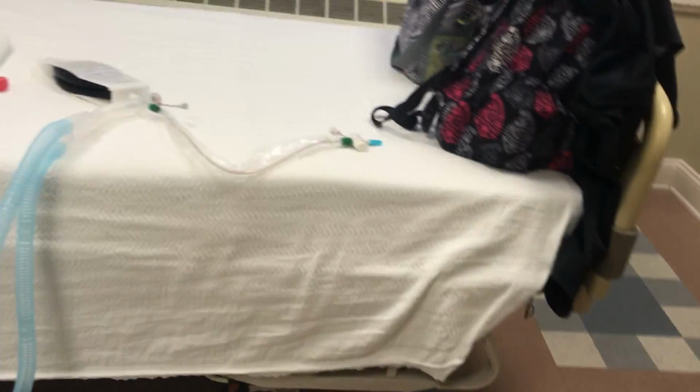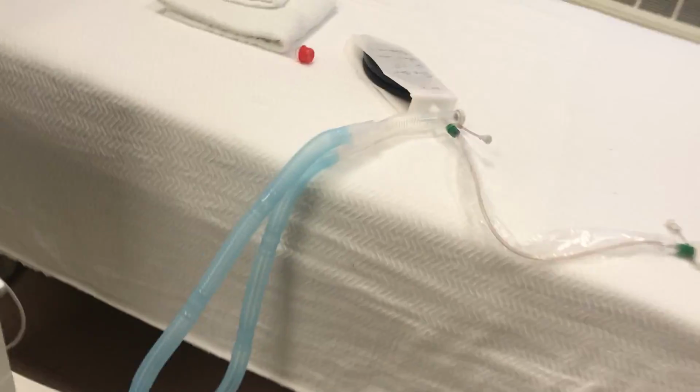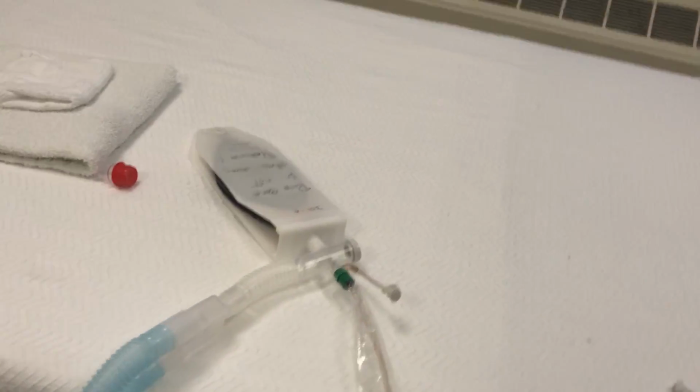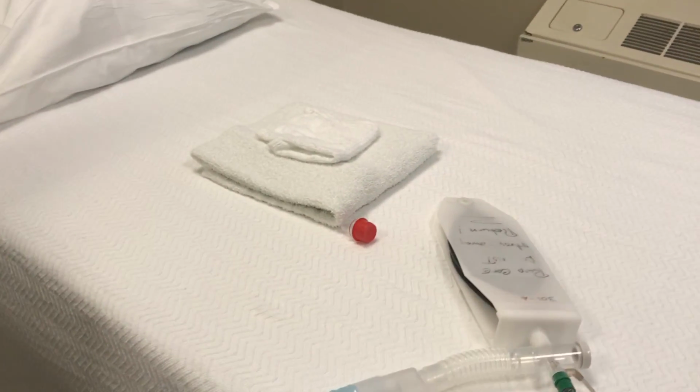I'm going to do a patient ventilator check. I'm going to go grab some gloves on the way in and go introduce myself, explain what I'm doing. I'm just checking the ventilator. I'm going to make sure. And I'm going to do an assessment on you.